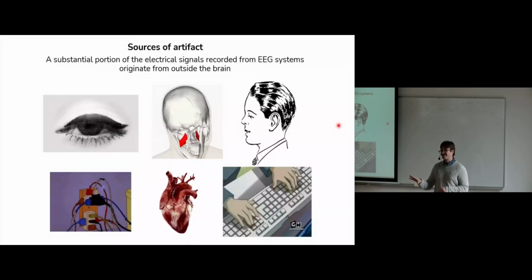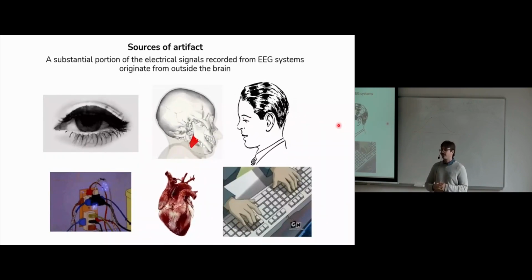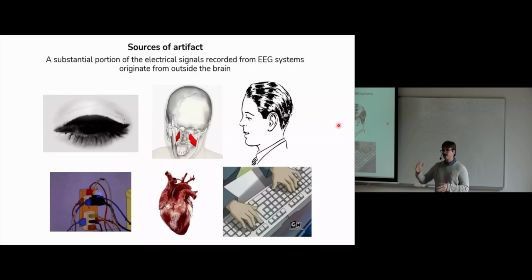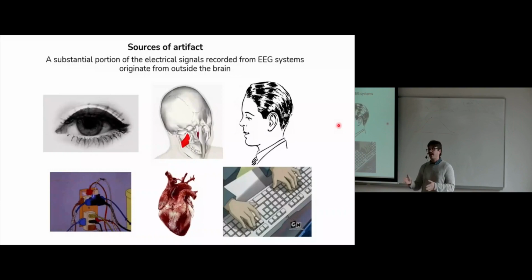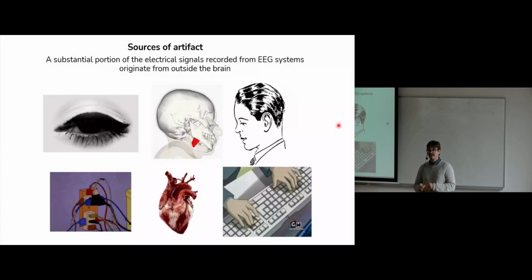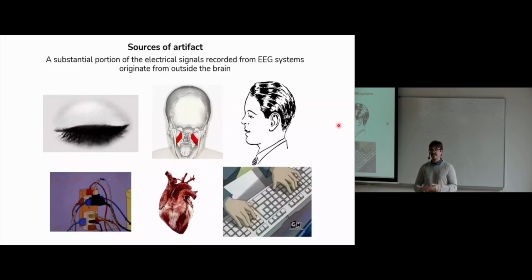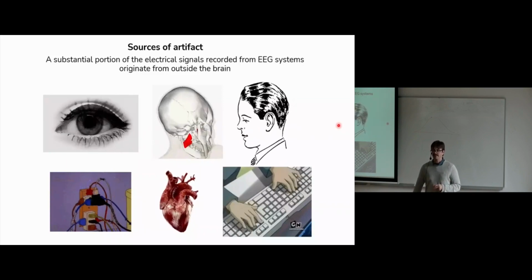They briefly paralyzed themselves with this agent and showed how, after 20 hertz, a lot of the power of the EEG spectrum goes down to near zero in the paralyzed EEG, which means that most power above 20 hertz is driven by tonic artifact. So we can do a lot of artifact cleaning procedures, but we still expect a lot of tonic artifact in EEG. This is not obvious EMG that you can extract with ICA. This is tonic power in the EEG.